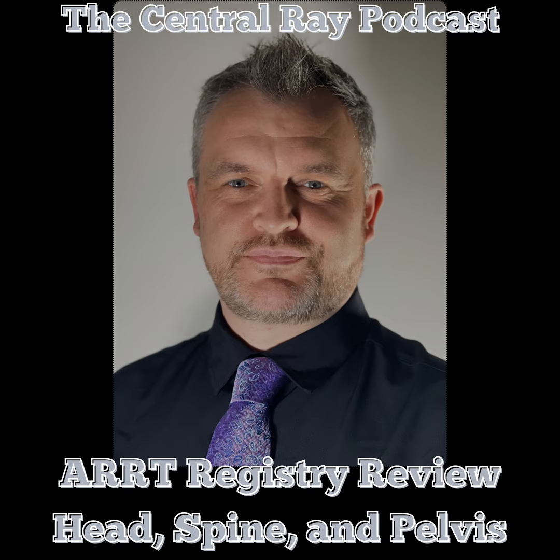For the lateral skull, it's all about superimposition. Look at the orbital roofs and the mandibular rami.